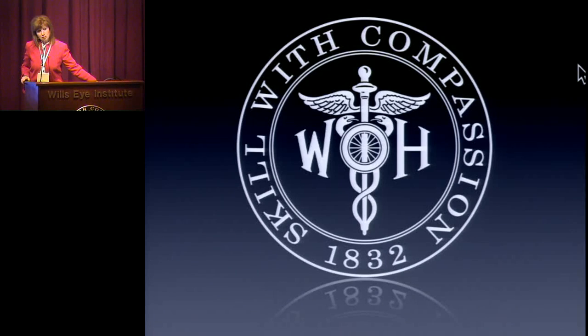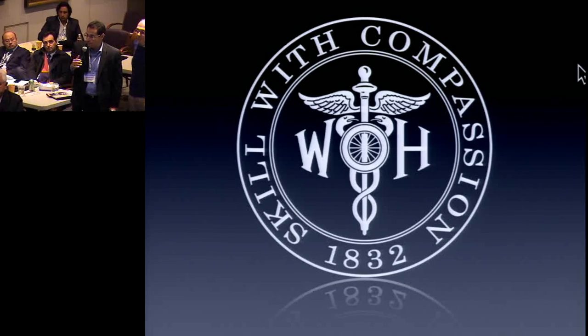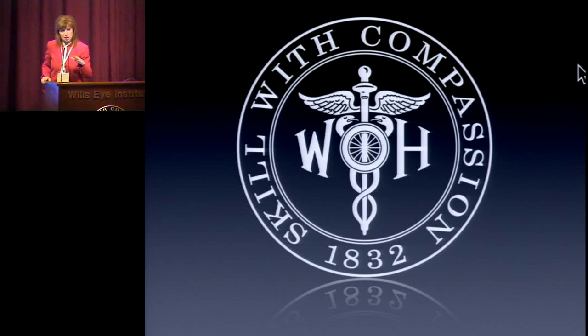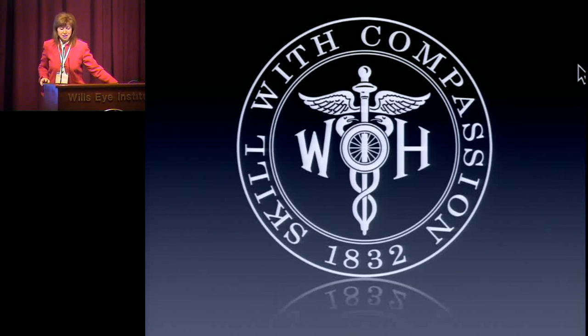The only point that I'm concerned sometimes is about the resolution of the machine, because the machine has a 10 micron resolution. We cannot consider a 5 micron change as a real change. But I totally agree with your thoughts. I think it also depends on which OCT you use. With the Spectralis that I have the most experience with, that's the Heidelberg, there is easily a 2 micron resolution that's acceptable. And after that, I really start paying attention. Not 10. 10 would be horrendous for us.